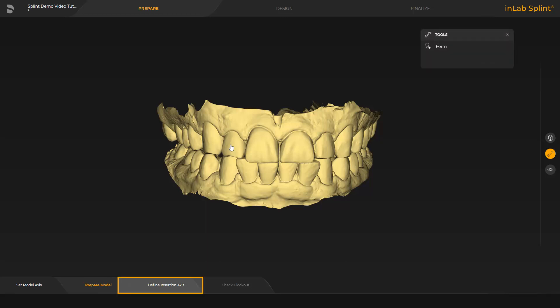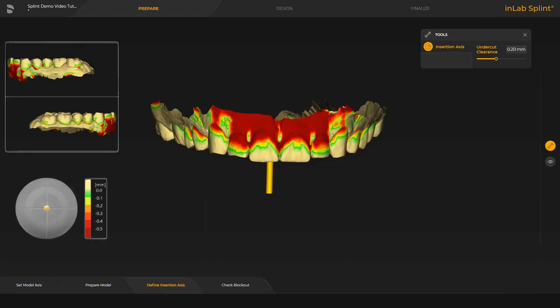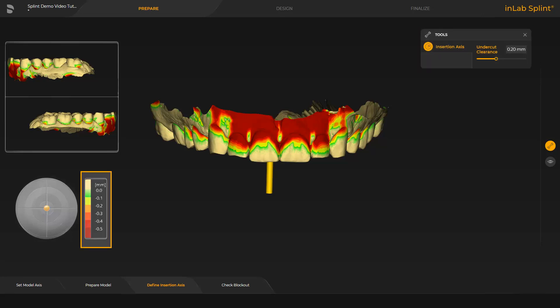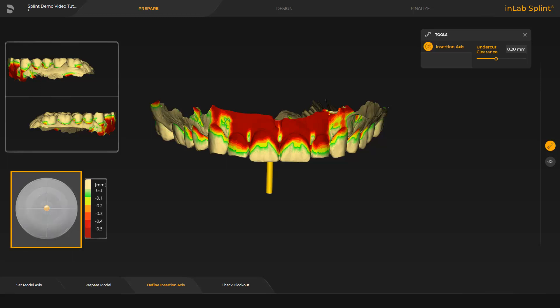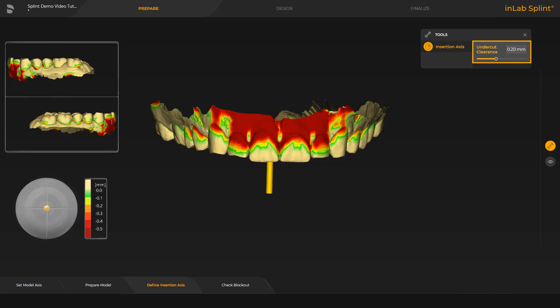Next, we switch to the Define Insertion Axis step. The Insertion Axis tool allows you to set the axis for blocking out the jaw. The undercut depth is visualized using a direct color gradient, from light green for a low depth to dark red for a great depth. The insertion axis itself is displayed with the yellow arrow above the center of the jaw. To adjust the axis, you can move the arrow with the left mouse button, or via the disc and the orange colored ball. When designing splints, you use the parameter Undercut Clearance to specify how deep the edge of the splint should be in the undercut.